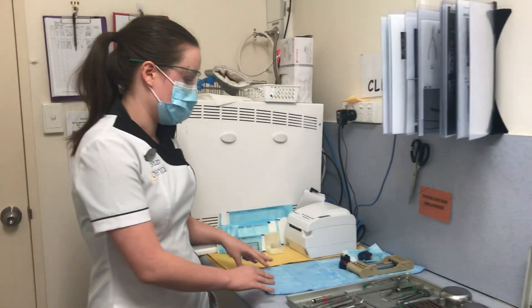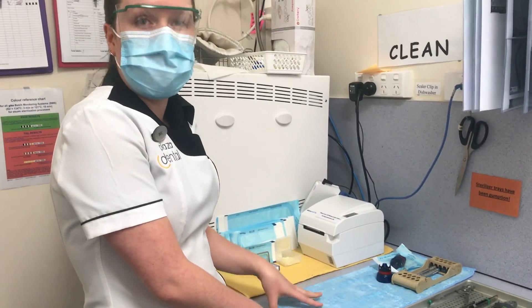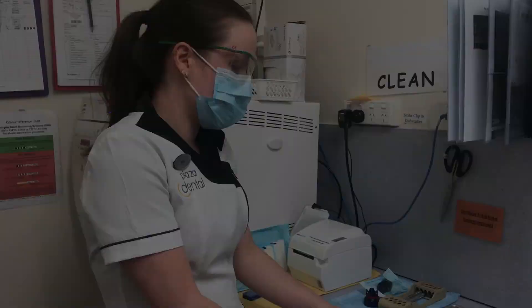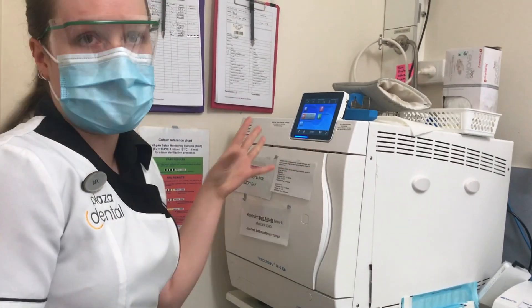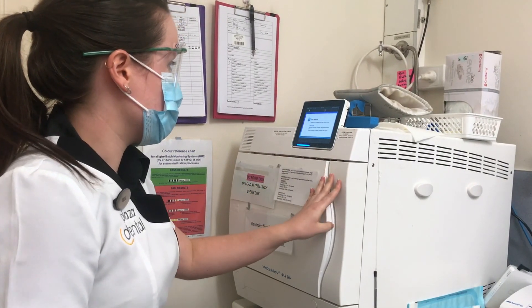We've also got a different section over here — this is our mini autoclave. Some of our instruments, depending on what they're being used for, need to be what's called sterile at point of use. Now that I've got my instruments laid out, we come over to our autoclave. There are a lot of different cycles, so it just depends on what you're trying to do. Then you just load your instruments into your autoclave.